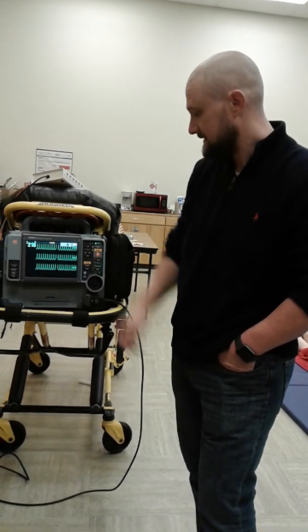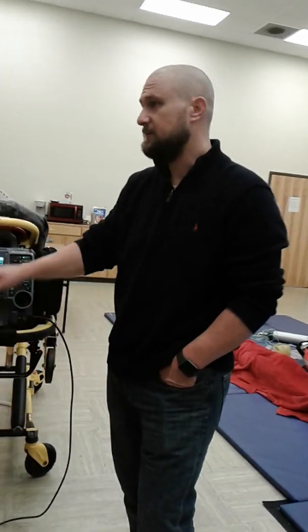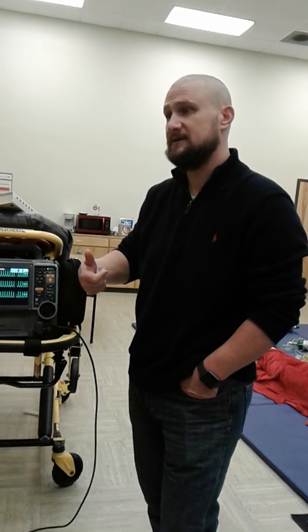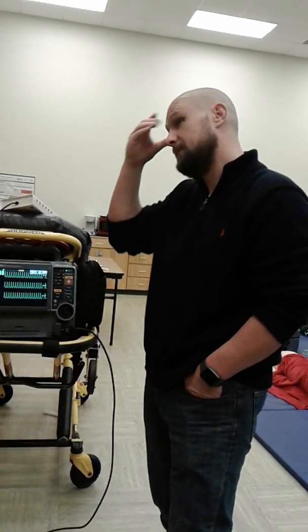Step number 3 is what? P wave. Can you look at that and tell me P wave? No. So step number 3 is out of play. Step number 4 is out of play because we don't have a P wave. We don't have a PR interval. Correct. All right. So next we look down at step number 5, which is QRS.